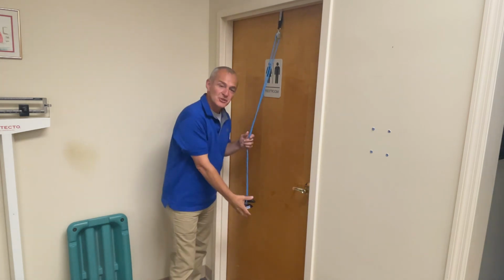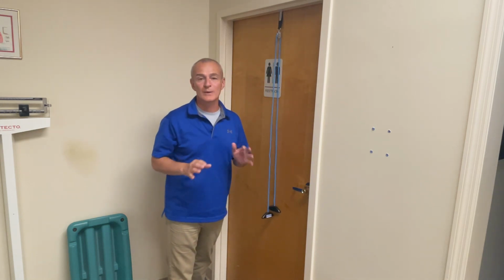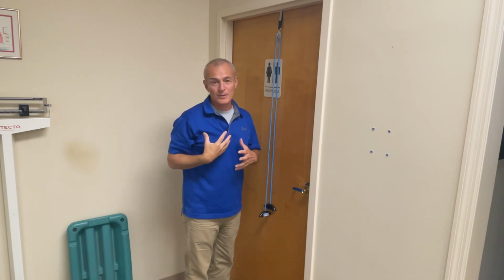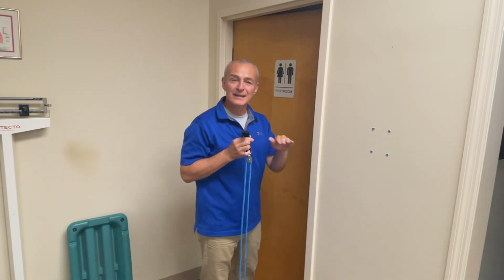You would place a chair behind the door and you could begin to do your active range of motion, passive range of motion, or whatever exercises were prescribed. But if you can't reach over the door frame, obviously you have a shoulder problem or maybe you're just not tall enough, you can also use this pulley system at a lower level.